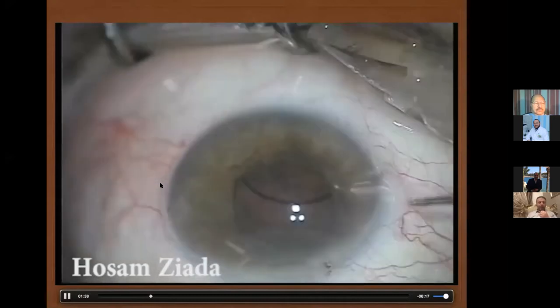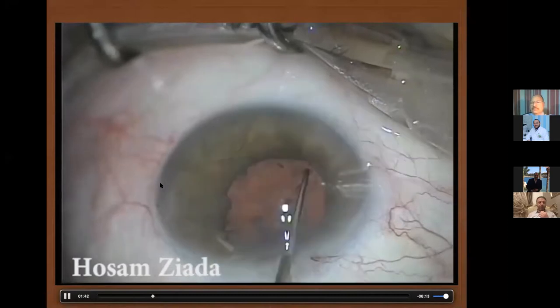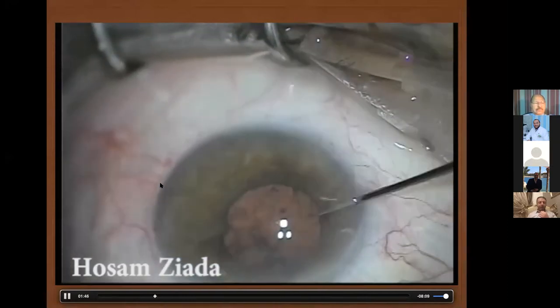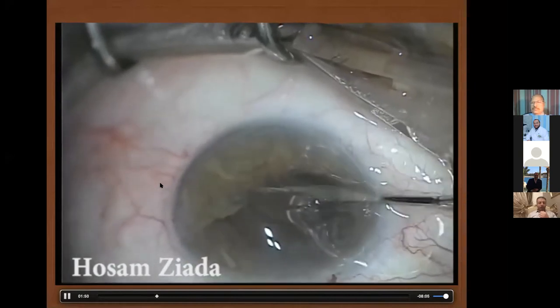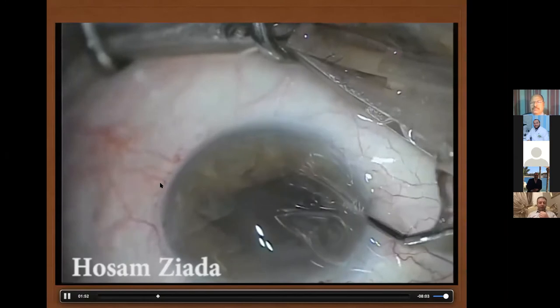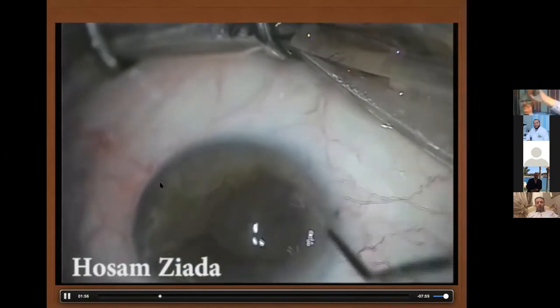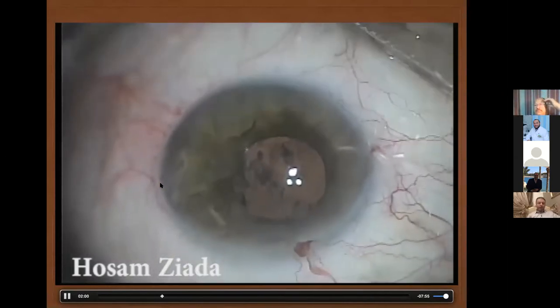And inspecting carefully and spying the fragments, not to be slipped posteriorly. Now I'm sure that the fragments are up and the IOL is below them. The point here: how to complete or extract these fragments.